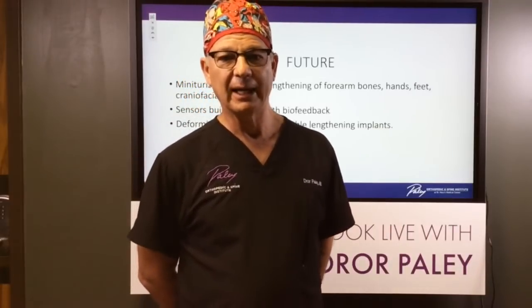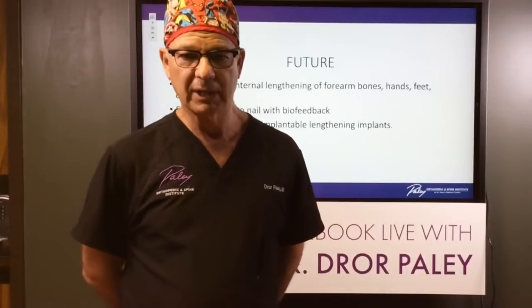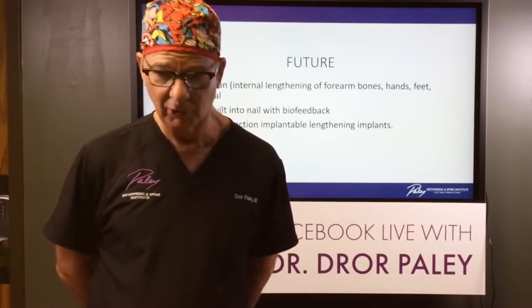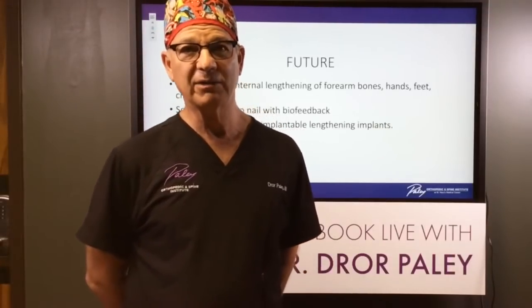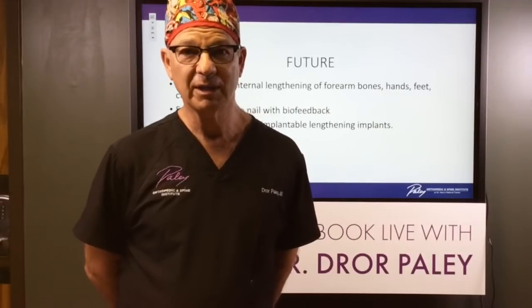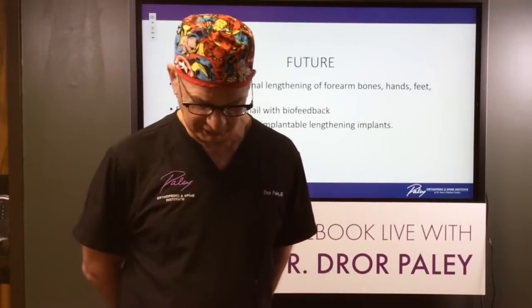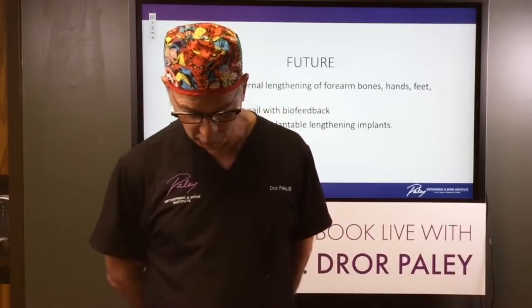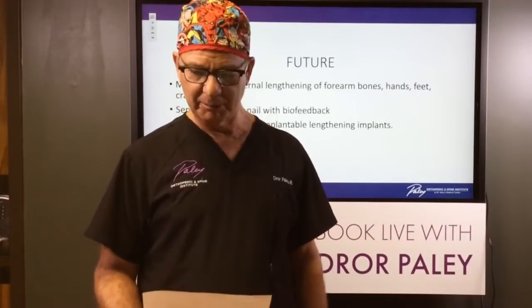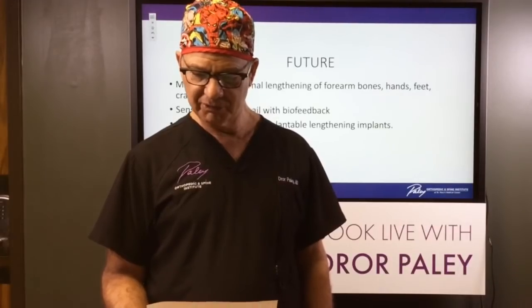Well, with internal implantable lengthening, the lengthening rate is still the same. So we always lengthen at whatever the safe rate is for each case. And the safe rate is based on how fast you can go and still regenerate new bone, and how fast you can go and still regenerate new muscle, nerve, skin, vessels, etc. In other words, soft tissues. The latter, the soft tissues, often govern the rate more than the bone. Bone usually can handle 1 millimeter a day of lengthening. The problem is the muscles, in particular, and the nerves can only handle a certain rate, and in different patients and different segments, it's a different amount.